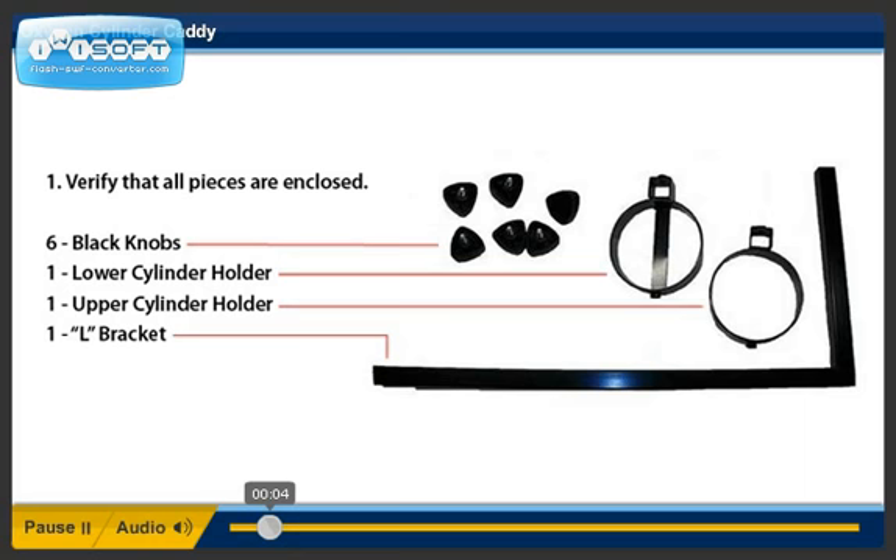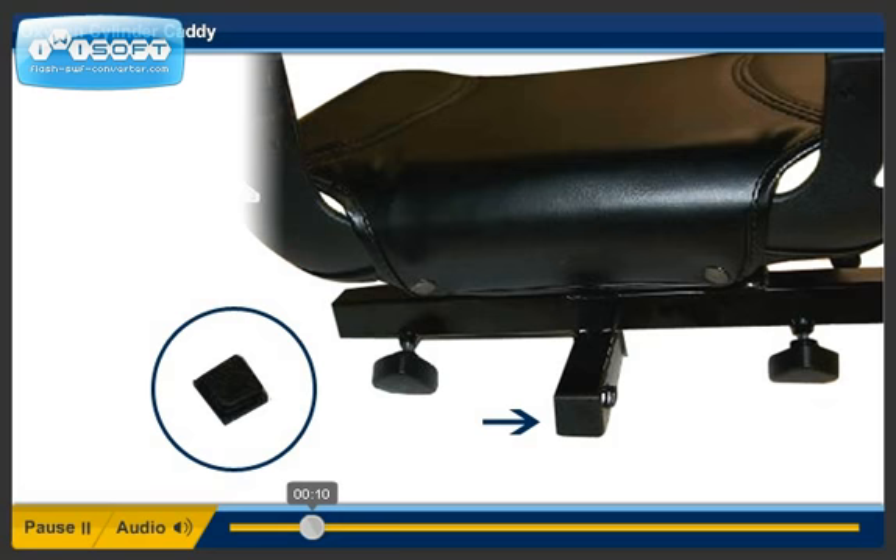Step 2. Remove the square plastic plug from the square tube at the rear of the seat.